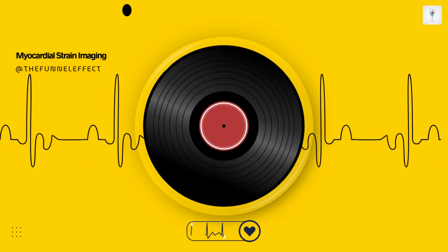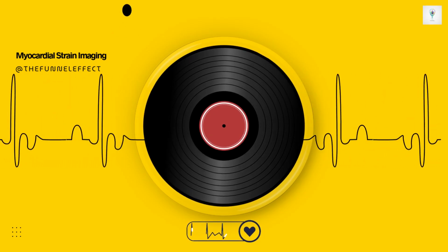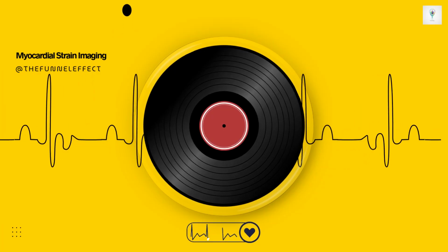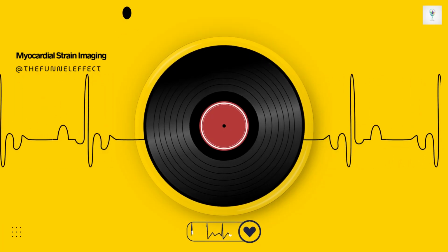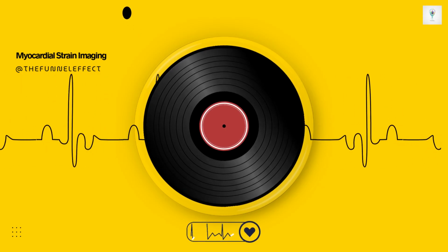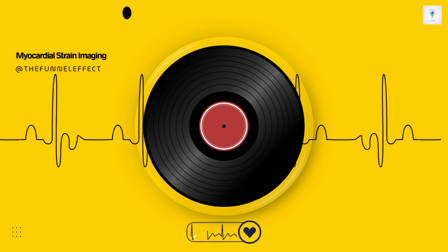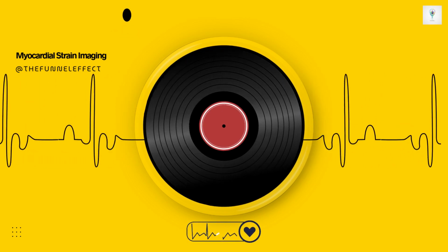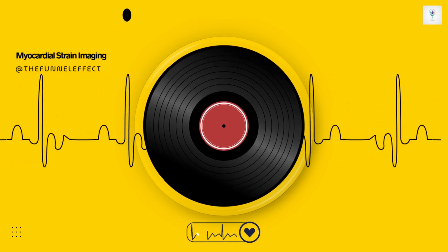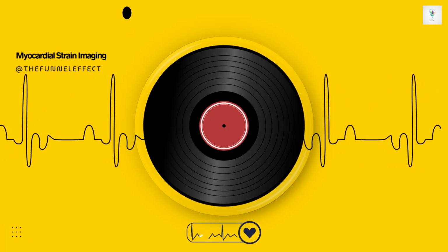Potentially up near those TDI levels, maybe 300, 400 frames per second, or even higher, using techniques like plane wave imaging. And getting that speed back would be a game changer. Because, as we mentioned, strain rate is thought to be a more direct measure of myocardial contractility than strain itself, less influenced by overall heart motion. Reliable high frame rate strain rate measurements would potentially give us a much purer assessment of muscle function.